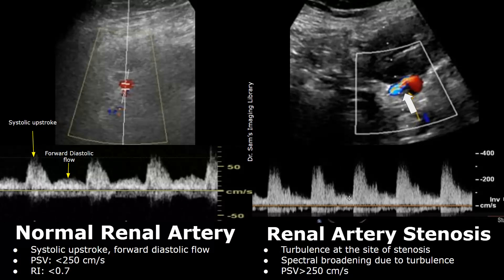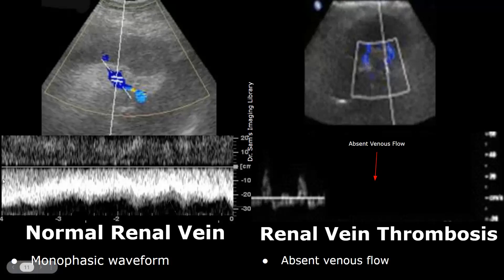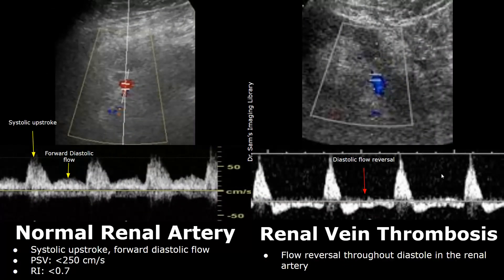This is a normal renal vein in our transplant — it will have a monophasic waveform. Here is a case of renal vein thrombosis. Usually we will not find venous flow, and we will not get any spectral waveform due to absence of flow, as blood flow is obstructed due to thrombosis. Renal vein thrombosis may also affect the spectral waveform of the renal artery.